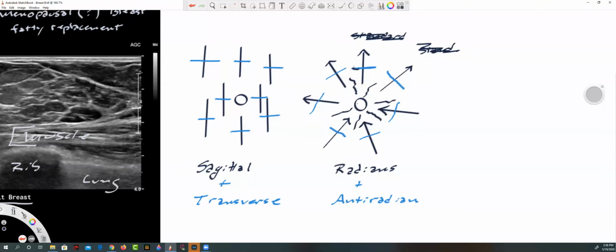I'll just put an arrow again. It's the standard transverse, and then I'll come around this way, and at some point I think I'd keep it. But over here, by the time I get down here, then I'm definitely turning my transducer around, because I'm not comfortable holding the transducer backwards. I'll probably change it here.